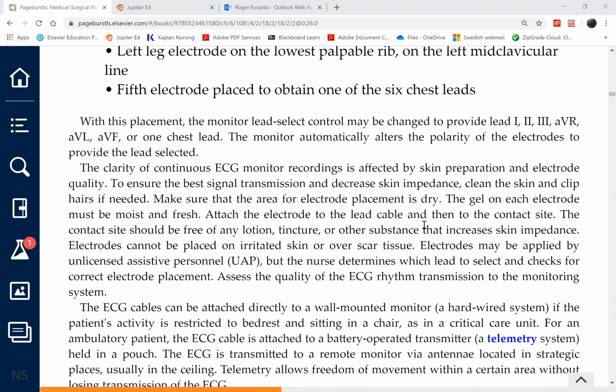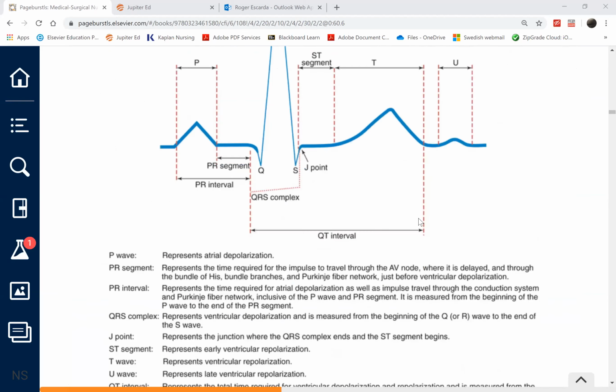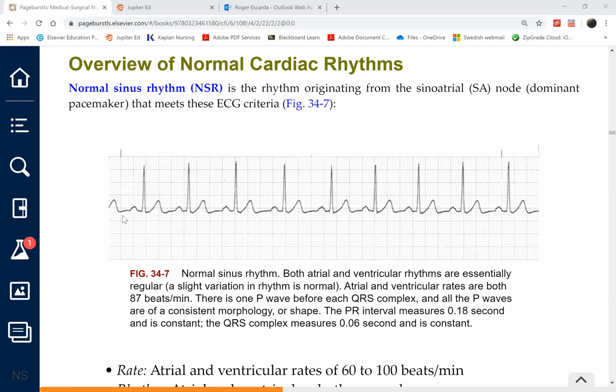Okay, on the EKG paper, let's use this one. As you can see, the waves and complexes do not really fall on a solid line, right? Yeah, they don't. So there's an imaginary line from which each wave, let's say the P wave, rises and falls back. You see it?